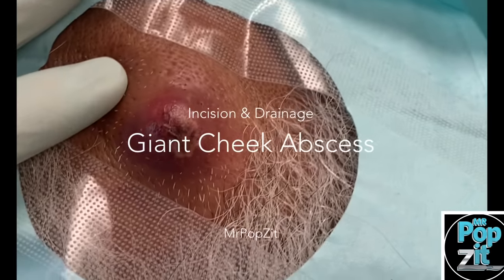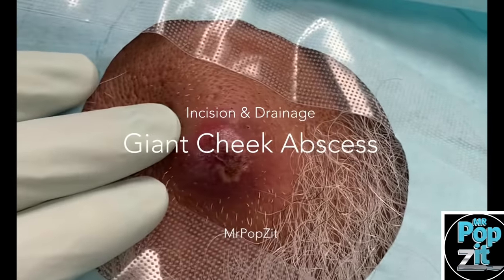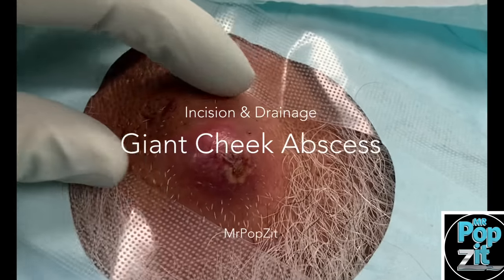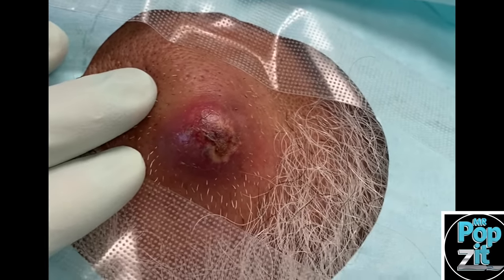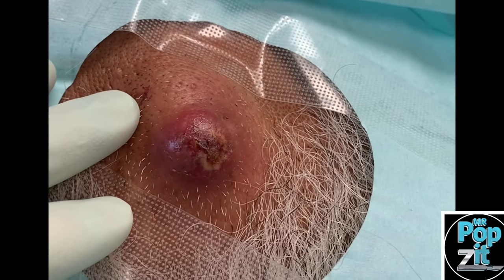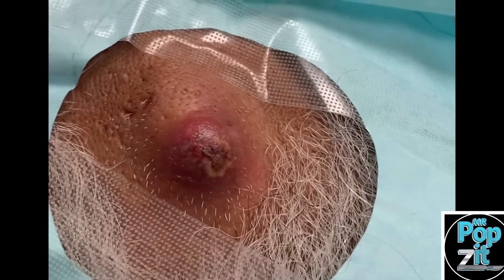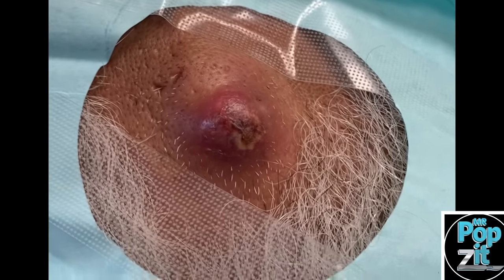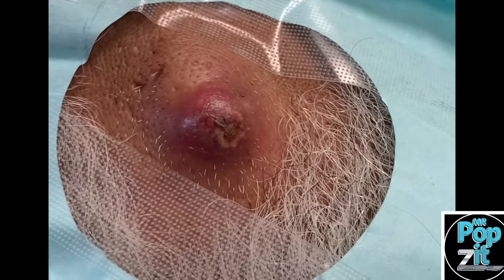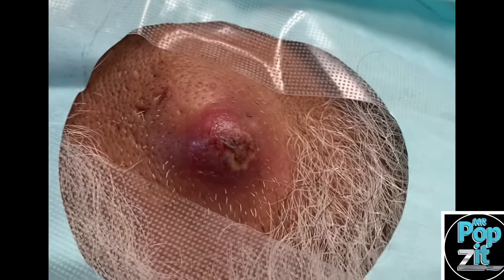We have here a large inflamed cyst that's kind of turned into an abscess on the cheek. It's a good three to four centimeters across and pretty raised up. We're going to do a little bit of lidocaine, but the acid-base shift we talk about constantly with inflamed lesions or bacterial abscesses switches the acidity, and our lidocaine is acidic, so it does deter and deplete how effective it is.